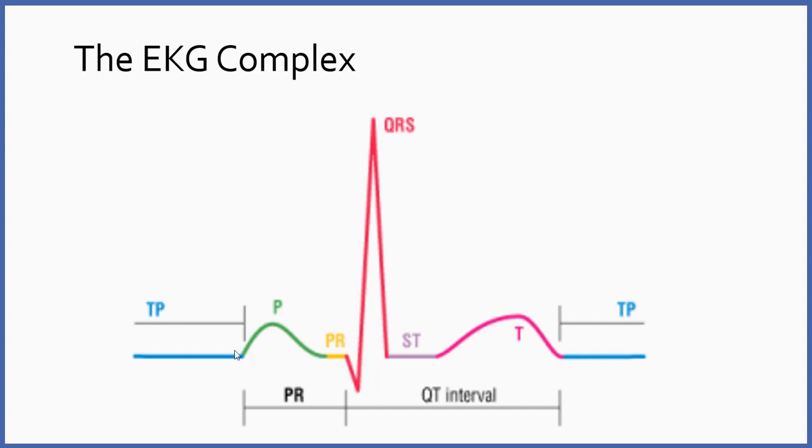So somewhere right around here, before the P wave, the SA node fired. And remember that SA node sets off waves of depolarization in the atria, and atrial contraction should occur. So this is the wave of depolarization that's measurable, moving through the atria. Contraction always follows electrical. So here's electrical, contraction of the atria is occurring right here, okay? Now the P wave should be upright and rounded like this one. It shouldn't be upside down.